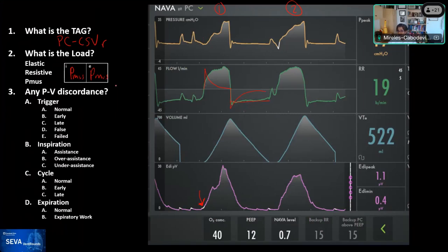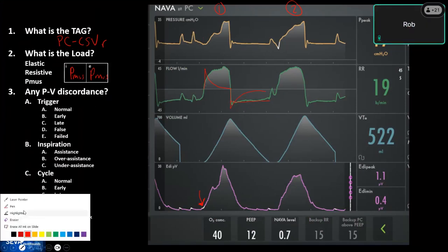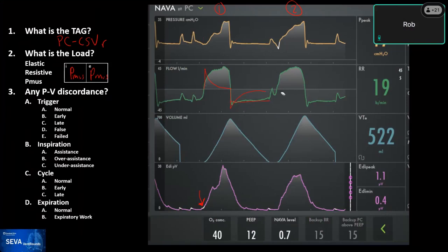Yeah, there you go, Karsten. Good job. Rob? Yeah, that's great analysis. It's hard to distinguish between those two things. I suppose if you were standing there looking at the patient, you could just put your hand on their abdomen and see what they're doing, right?